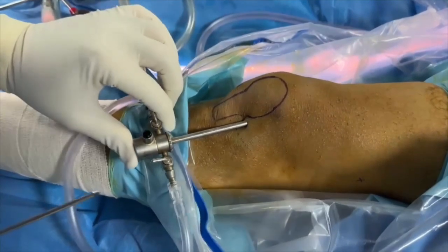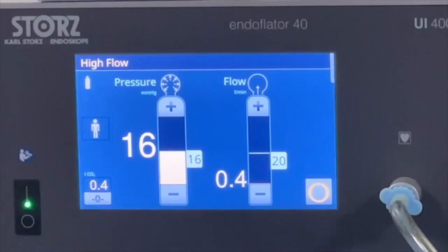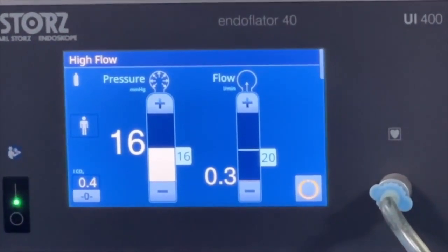After placing a standard anterolateral portal, an insufflator fills the knee joint with carbon dioxide gas up to a pressure of 20 millimeters of mercury.